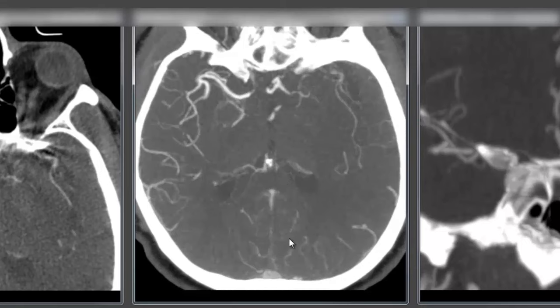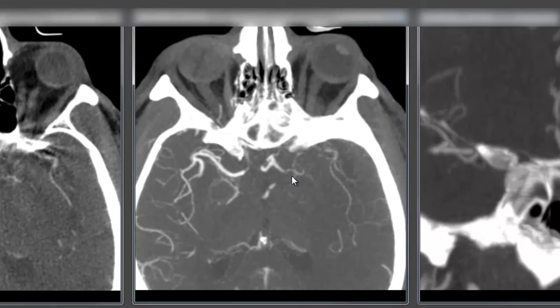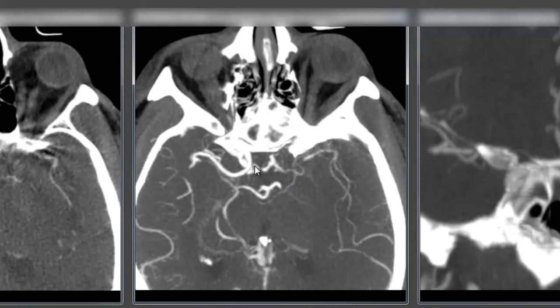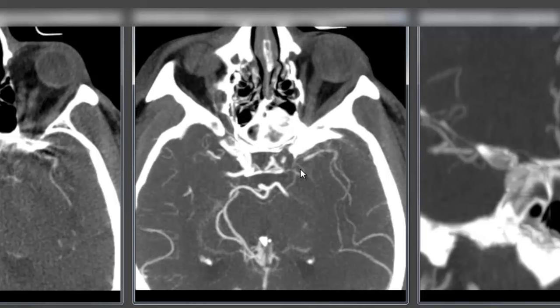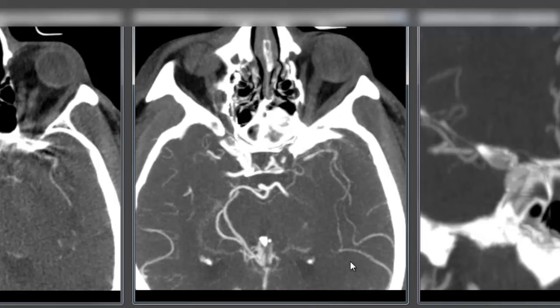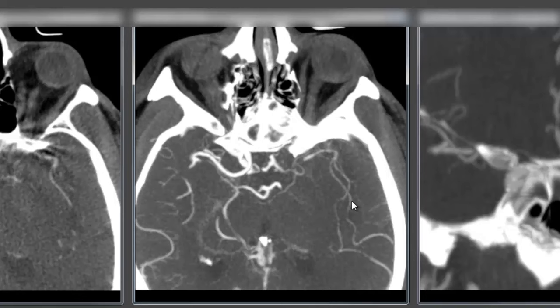If we look at the axial thick MIP reconstructions we see a similar picture but better visualized. Again we see the normal carotid here, no filling of this carotid which appears to be a clot at the carotid terminus with some reconstitution by collateralization down to the level close to the clot in the middle cerebral artery but very thready contrast opacification in the MCA territory.